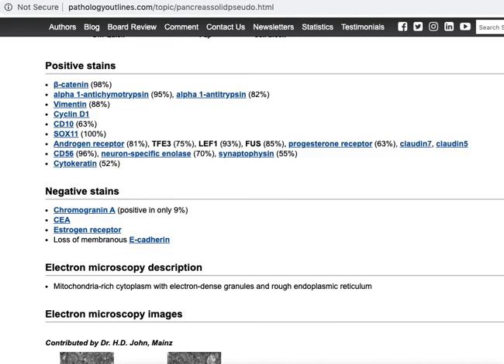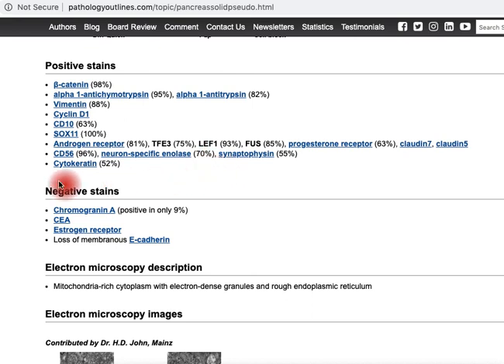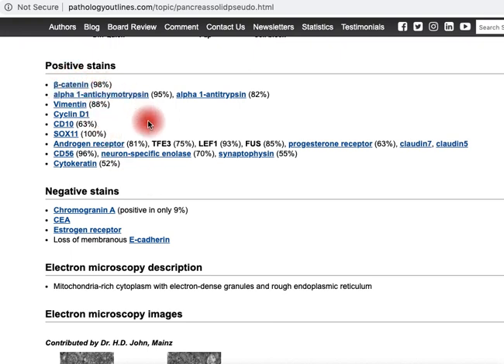If we jump quickly to the immunohistochemistry component of PATH outlines for solid pseudopapillary tumor, you'll see here that under the positive stains there are a number of things that could be potentially confusing. CD56, neuron-specific enolase, and synaptophysin are all positive in a significant number of situations. It's also often cytokeratin positive. The beta-catenin is perhaps the more specific, given the differential diagnosis in this situation.